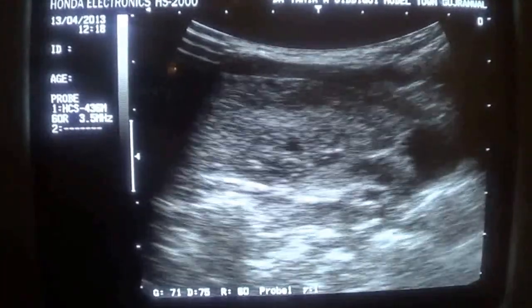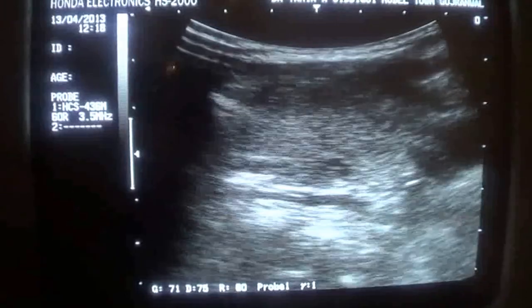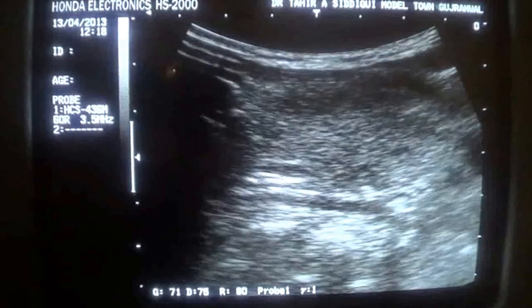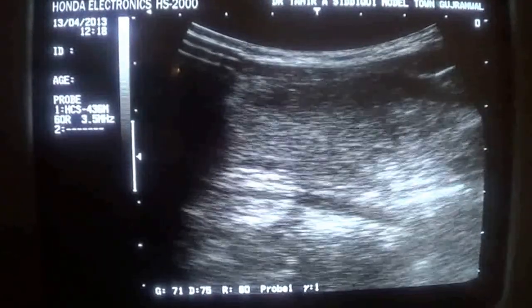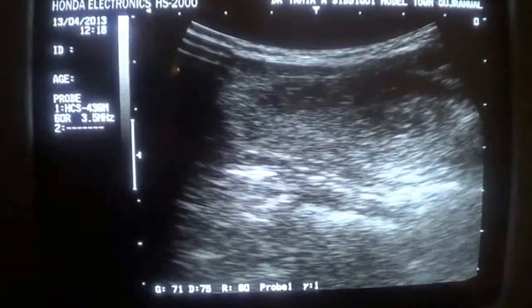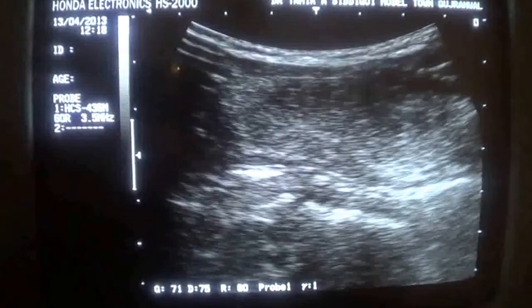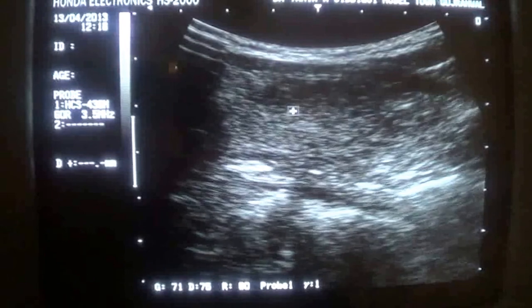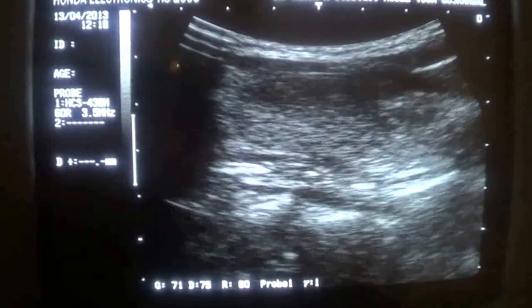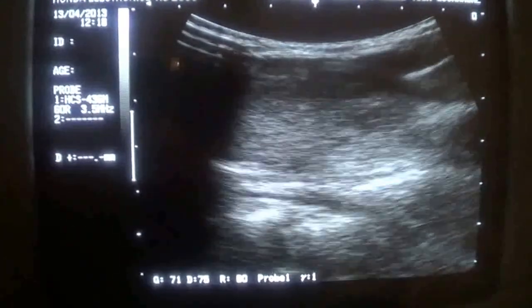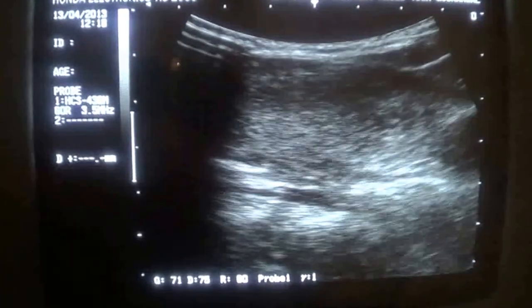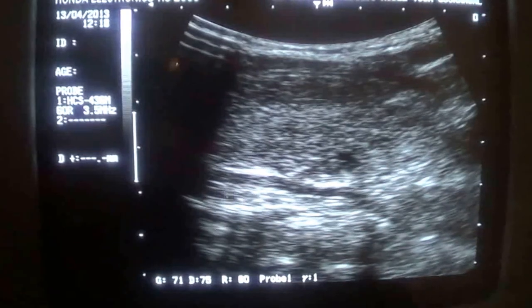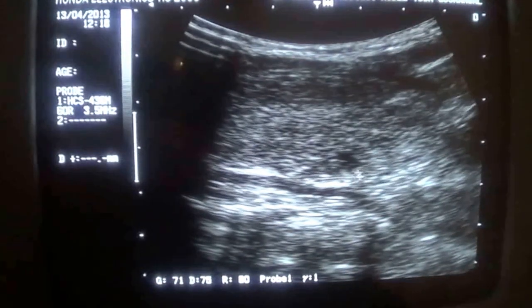This is the left lobe of the thyroid. There is no cystic area, no solid area, no calcific region seen relating to this longitudinal section of the left lobe of the gland. This is the common carotid artery in longitudinal section — the landmark for the identification of the gland. This is the parathyroid gland.